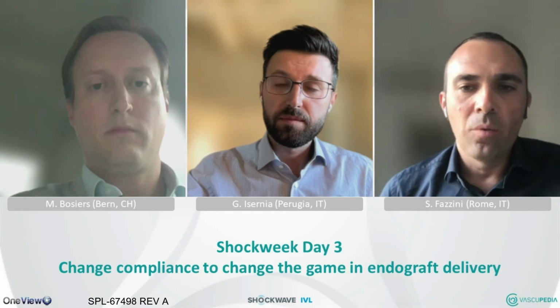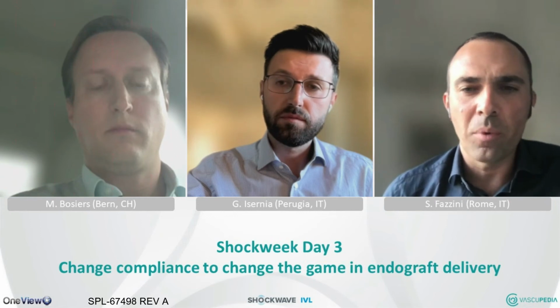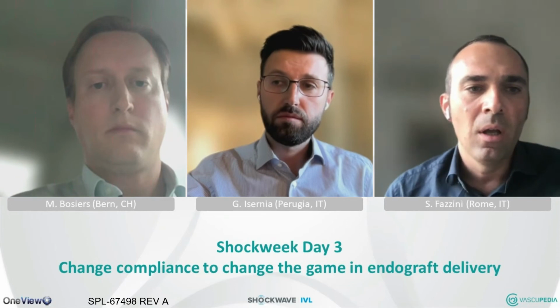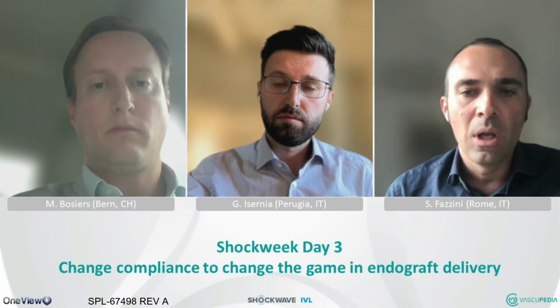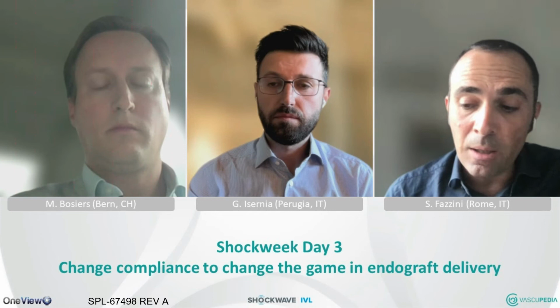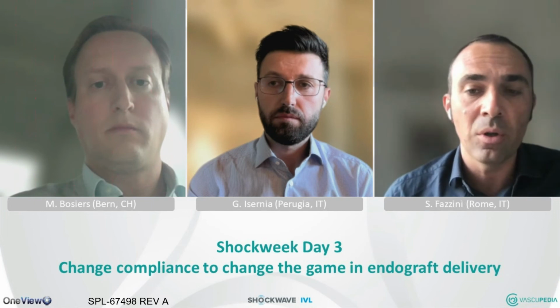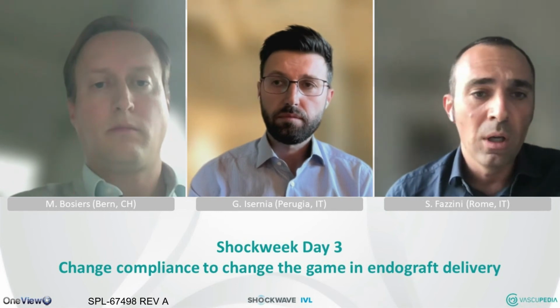Yeah, the same for me. I had no complication. No rupture, no dissection, and just in one case, probably the second of our ostiliac experience, we needed the paving and cracking after the IVL. So in a female thoracic endograft with a small external iliac, probably that was the only paving and cracking afterwards. I totally agree. And we had also no embolization, also for peripheral use, and probably the subintimal use could be also a solution for the FEMPOP disease.